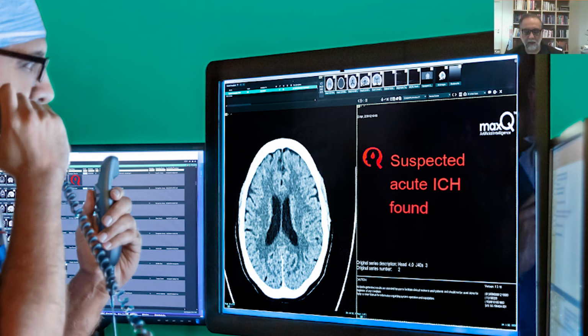So I think you'll find in general, almost 100% across the board, at least in my experience, the radiologists have been pretty skeptical about the whole thing. And a lot of times it comes down to usability, integration into our workflow, and value. Obviously, there's cost involved in some of these applications. And what value does it bring to the whole work proposition? Does it increase work? Does it make our work more fluid? Does it provide more value that's demanded by other specialties? Does it attack tasks that tend to be very onerous and drudgerous and take care of what I call the hamster wheel type things, like measuring volumes of hemorrhage and things that tend to be difficult and time consuming, but sometimes we have to do them.